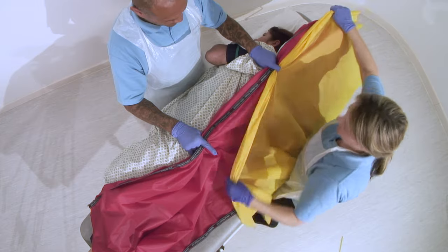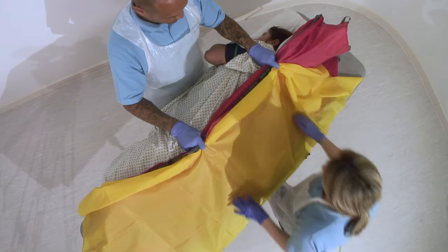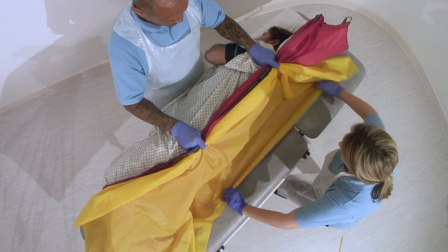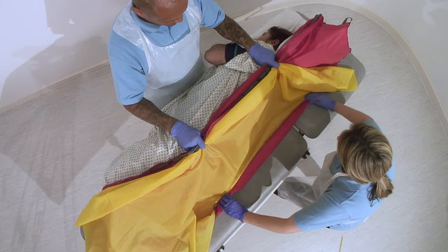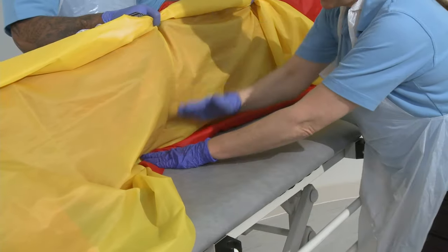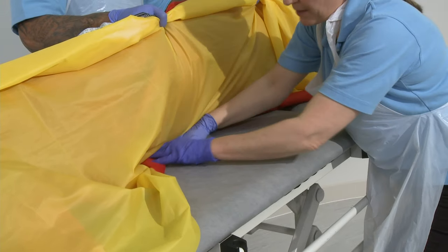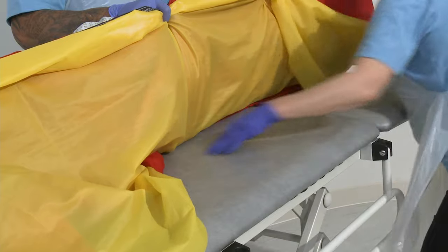Tuck that up underneath there, tuck that into there, bring that down. Take it in against my patient and now I'm going to roll it up concentrating on the hip and shoulder towards my patient. Flatter the hand, side of the hand, push down into the mattress and help that slide sheet underneath our patient all the way along.